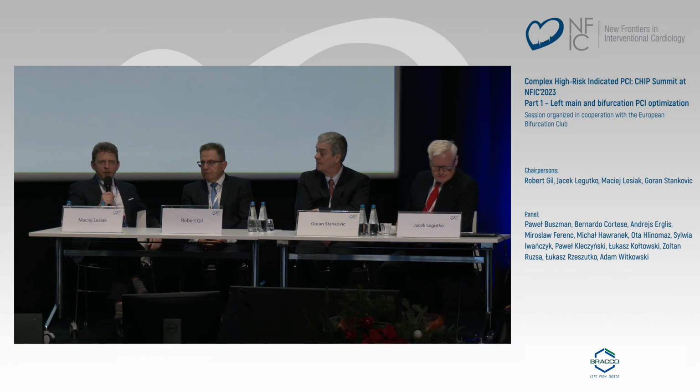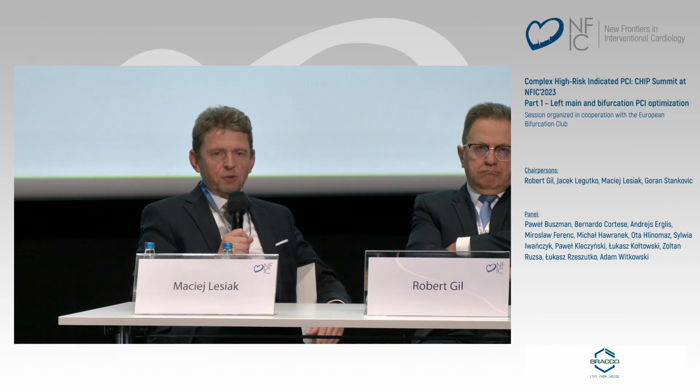Yeah, as for the left main, I still stick to IVUS because there I have more experience, more clinical data, and so definitely for ostial lesions it's difficult with OCT. That's the point. But in other cases, in my practice, I love using OCT for bifurcation. It gives you a lot of important data. You can assess, for example, from the main vessel pullback, the status of the ostium of the side branch, which is not easy with or impossible with IVUS.